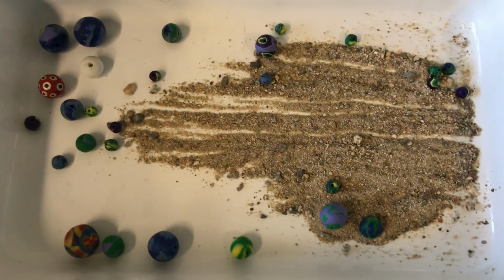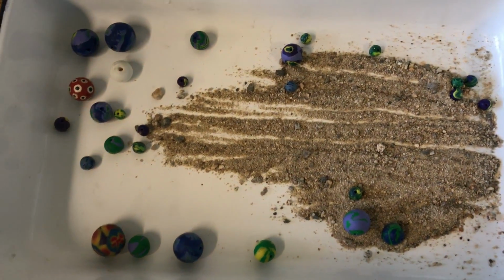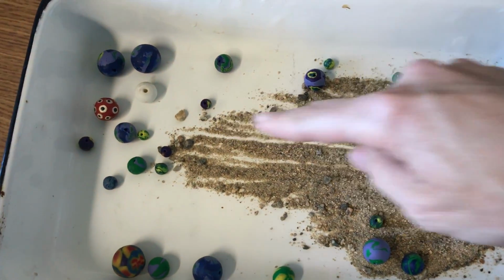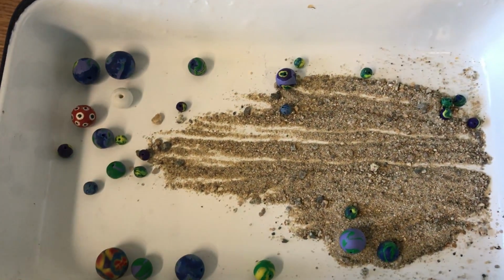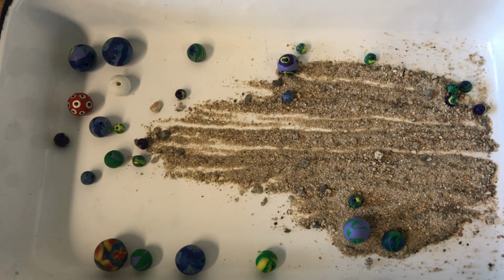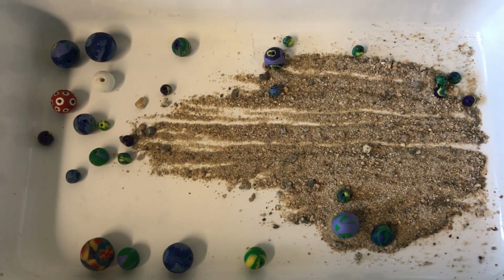Alright, so I'm going to back my video up, and you can kind of get a sense of what happened. So you can see the drag marks through the sand. So down here you see these drag marks. So when I was kind of plowing the simulated blood across the slide, you can see that things end up in different places depending on their characteristics.